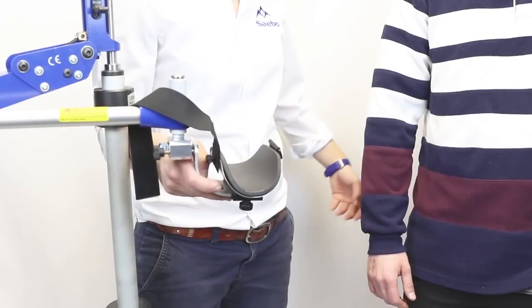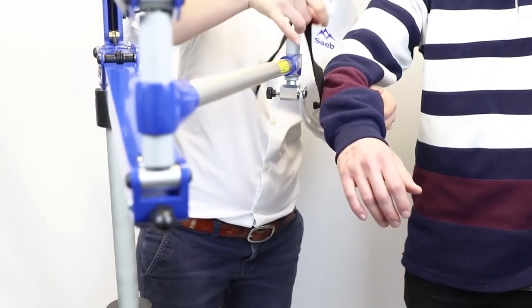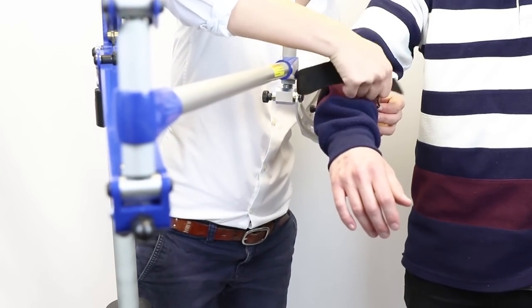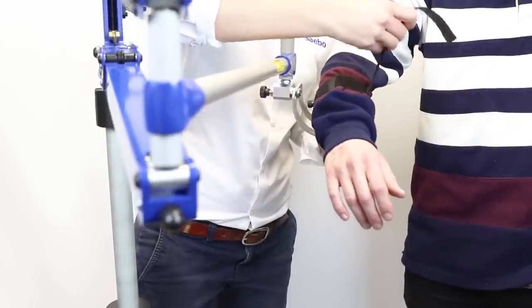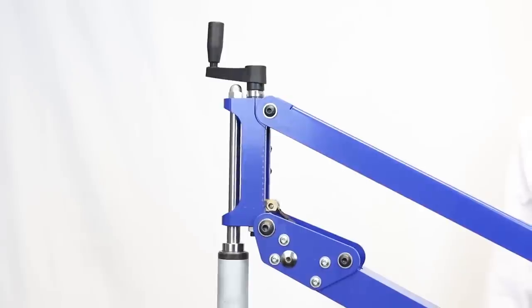When you're ready to put your patient in the device you want to place their forearm in the forearm support about two-thirds of the way up towards their elbow and secure the forearm strap tightly. You then have the option of using the tension scale to increase the assistance when they're moving.